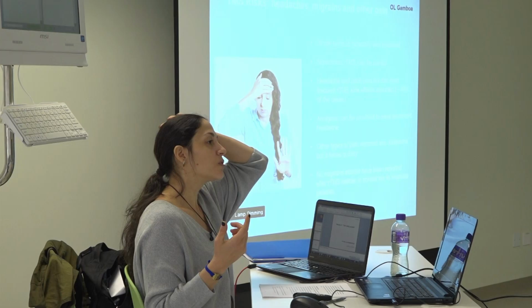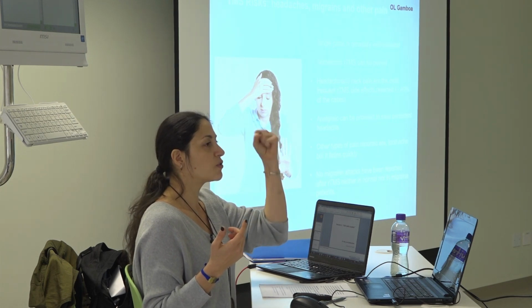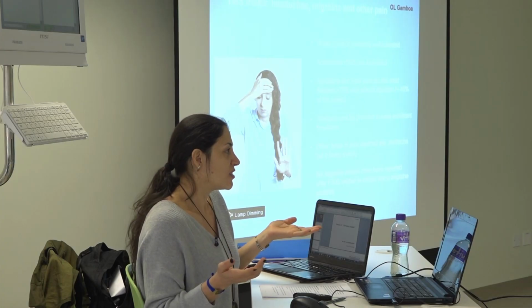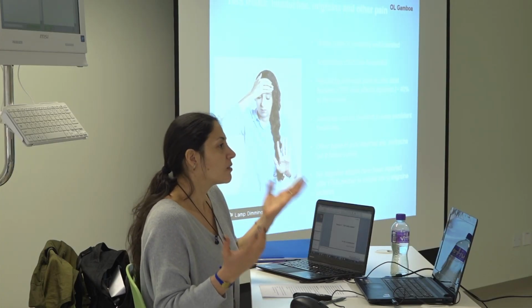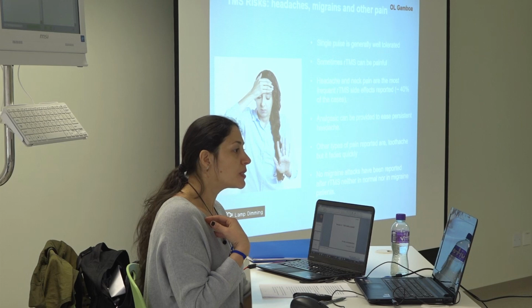What I have seen, like I said before, is that when you stimulate the frontal region, it contracts your facial muscles. It's quite painful, I find. But people bear it quite well, and once you stop stimulating, it passes. It doesn't stay there, but you feel the pain, and you can bear it or you can stop the study. No migraine attacks have been reported after rTMS, neither in normal nor in migraine patients. That has also been my experience. I haven't had problems with migraines.